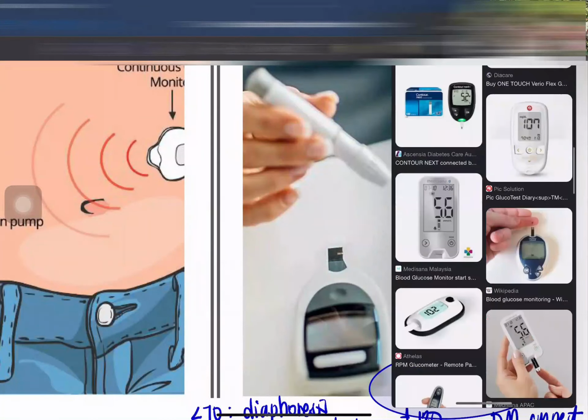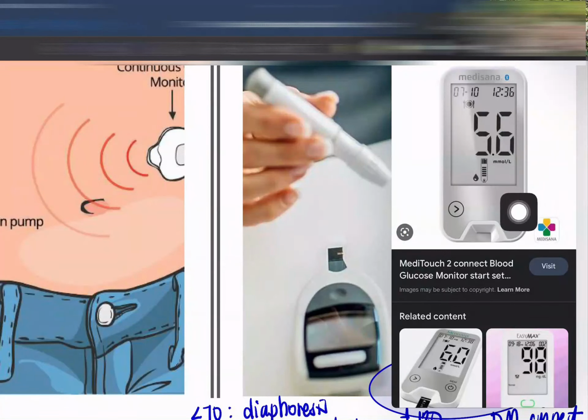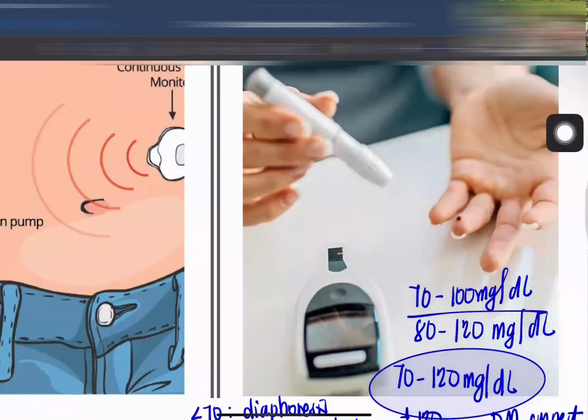This machine has the same purpose, it also reads blood sugar levels. But by the time I park the machine, as in I place it in its receiver, like a telephone that you return in place, when you put it back in place, it updates the network. And then anybody in the entire network will be able to see the blood sugar levels of your patient as long as they have access. Okay, that's one trend in technology already available here in our setting.